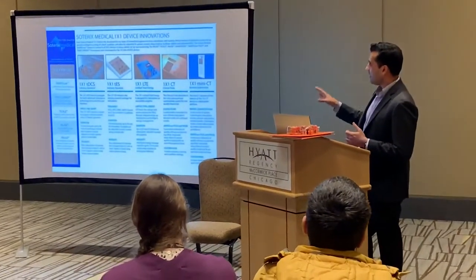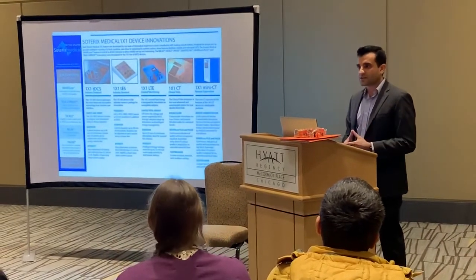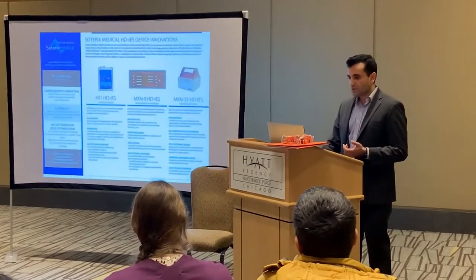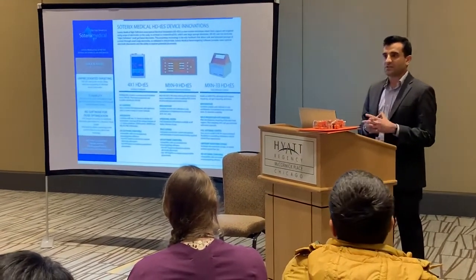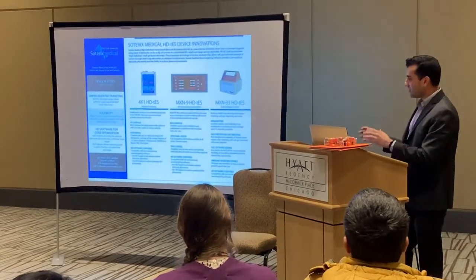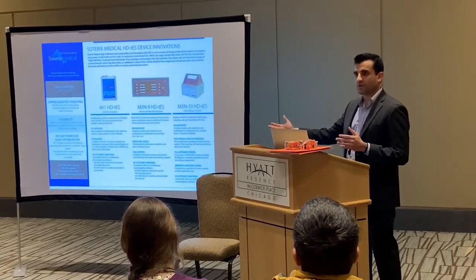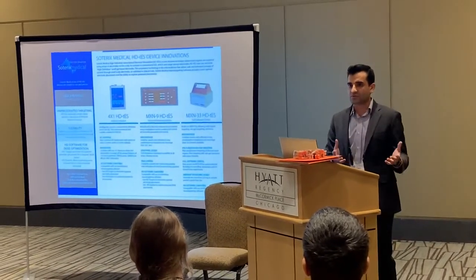Now, these are all TDCS, which is how this field started, transcranial direct current stimulation, where you use one anode, one cathode, and you use the sponge electrode. In 2008, we introduced the high-definition TDCS approach, which, instead of using two electrodes with saline solution, uses gel and electrodes, and you can use a lot more electrodes to get more focality. It started with a 4x1 stimulation, where you have one anode and 4 cathodes around it.